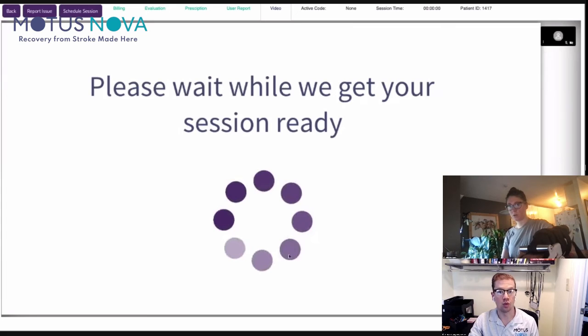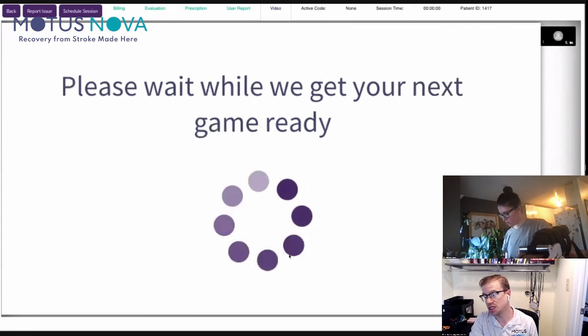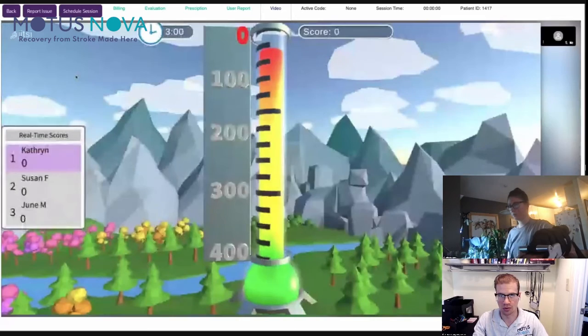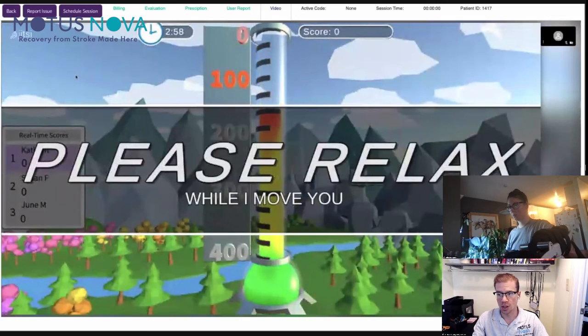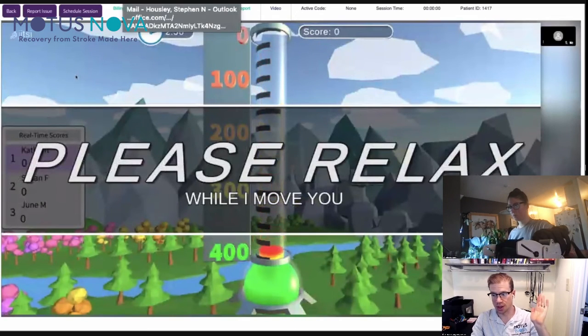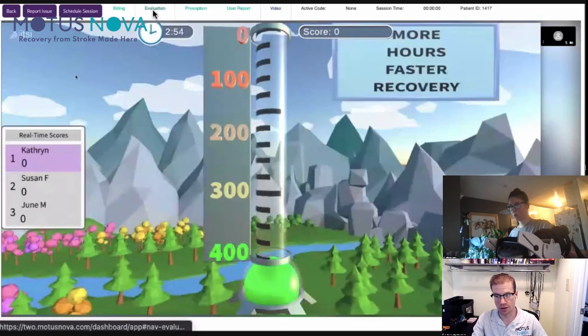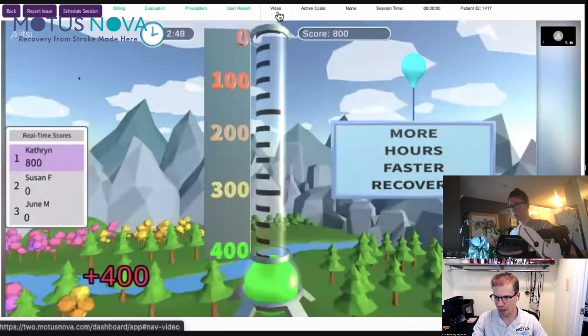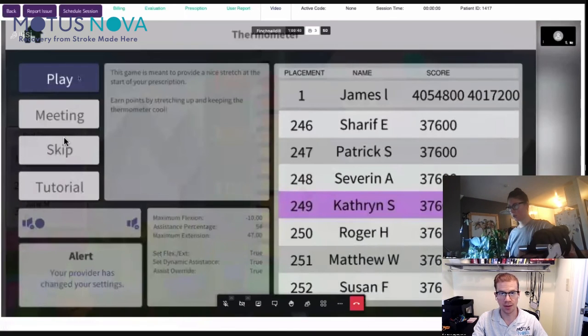But what I'll do is I'll come back around and then we'll just make sure that those data are working. If you do see the screen pause, don't worry, that's just me. But go ahead and hit play here and we'll just do our first session together, first rep here. So here, this one is trying to really move up into extension as far as you can. Oh, great. So we already have way too much. That's good. It's going to pause again. And that's just me. Go ahead and hit play.